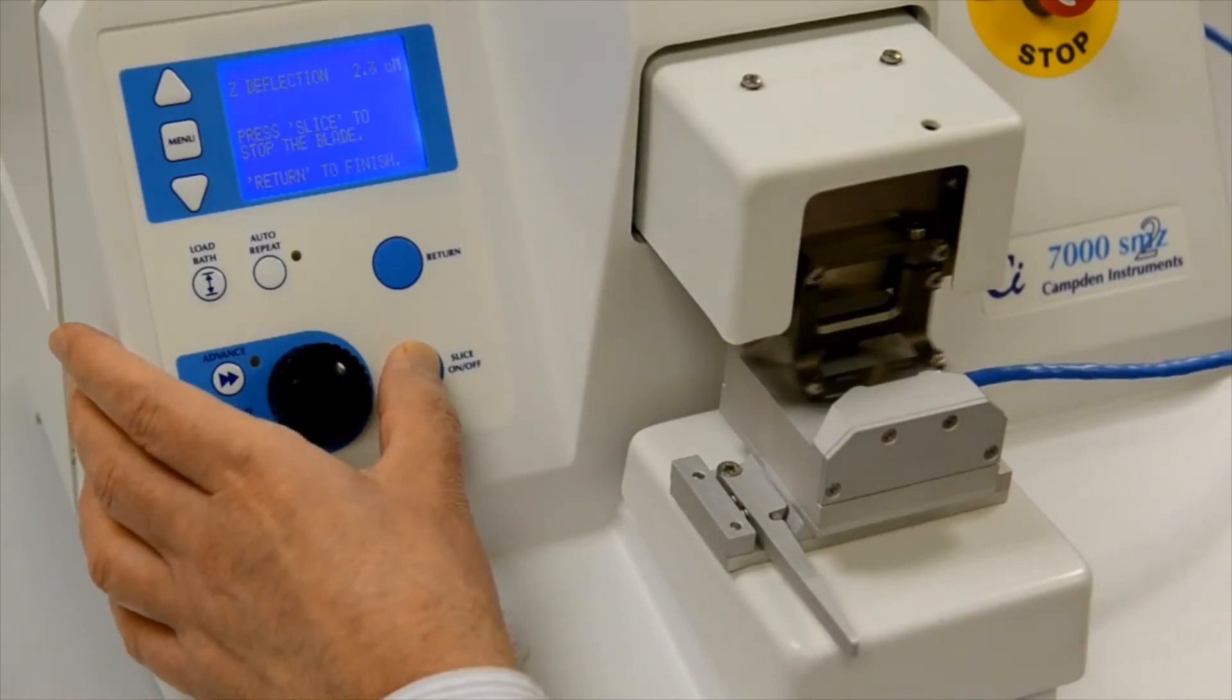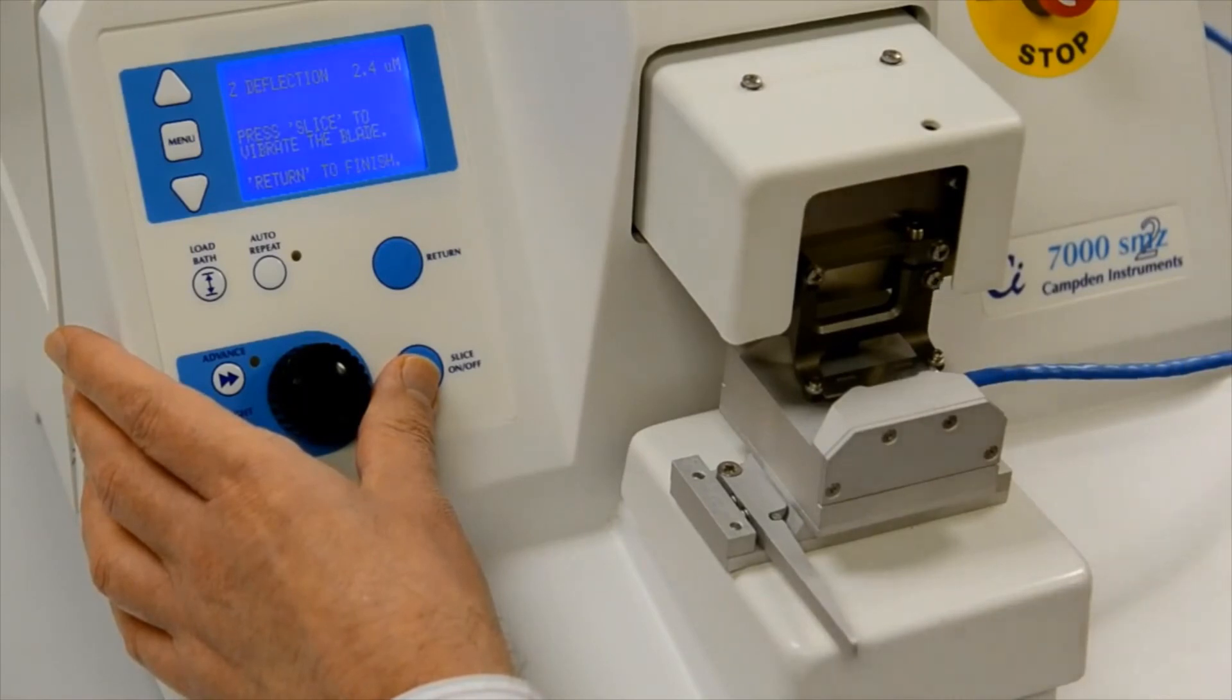Retighten the lower screw and press the Slice On-Off key to start vibration. The Opti-Cal will reassess the blade alignment error.